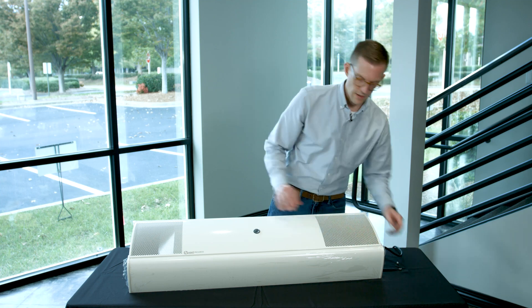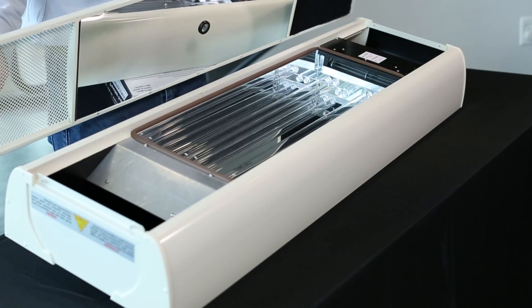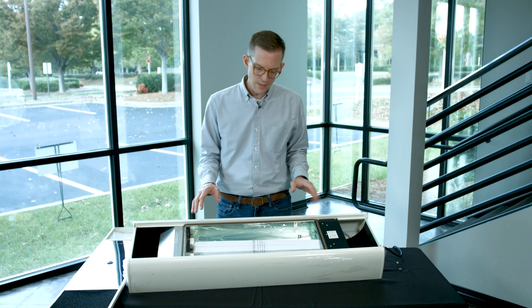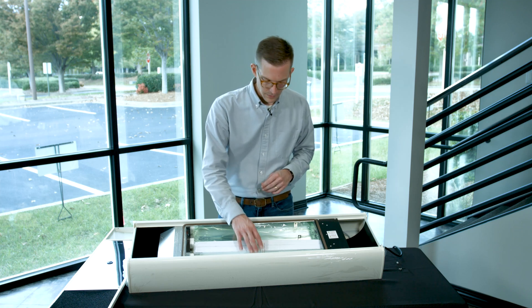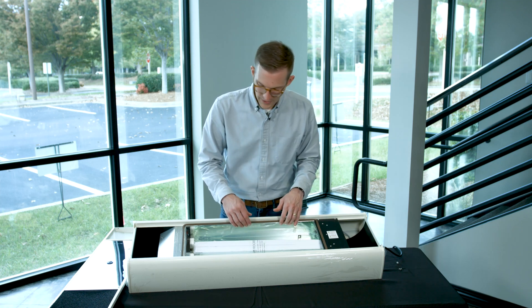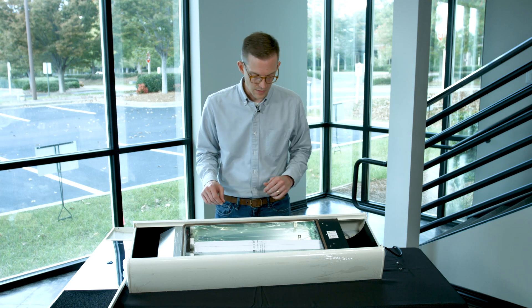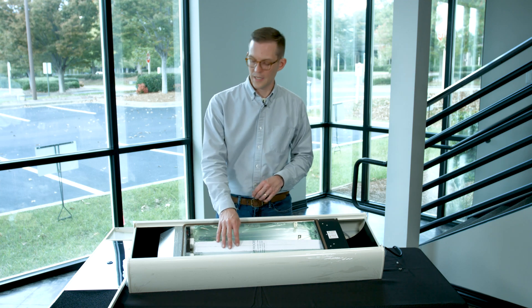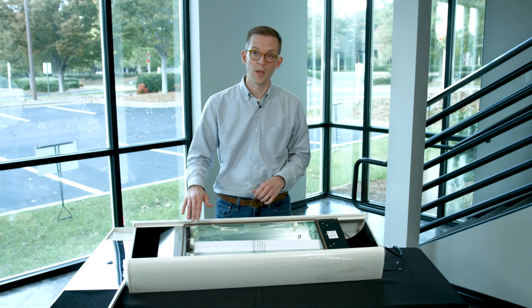We have our four screws removed and now this cover simply lifts off the top. Inside the unit we have a couple of the germicidal ultraviolet lamps. We have this plastic coating that's protecting that highly reflective surface on the inside. So let's go ahead and pull these lamps out, install them in the sockets, and remove this plastic coating.